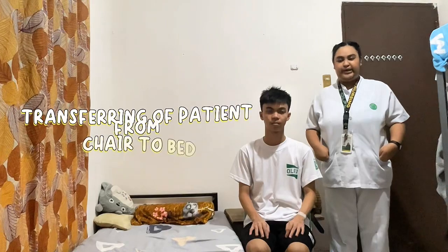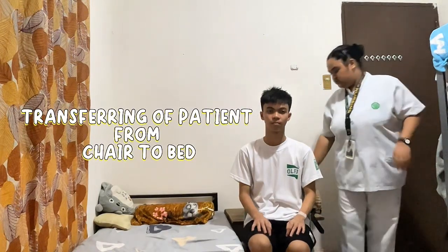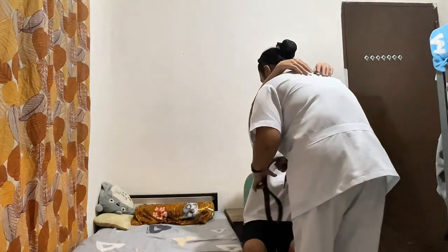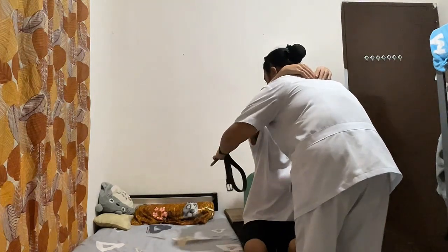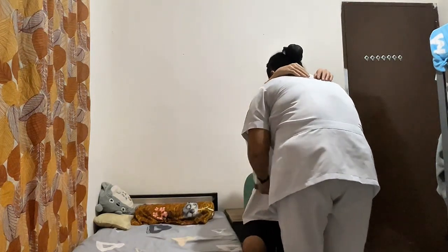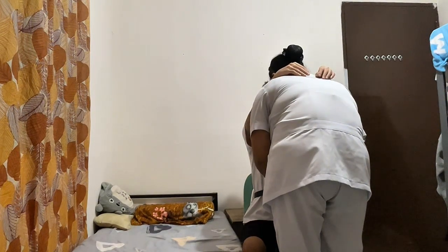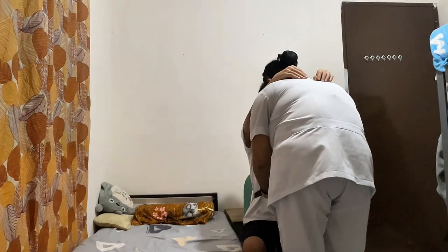So, since I am done with the transferring of patient from bed to chair, I will now transfer my patient from chair to bed. So, first is to ask the patient to put both his arms on my back and put the transferring belt on the lower part of the ribs of the patient and buckle it.